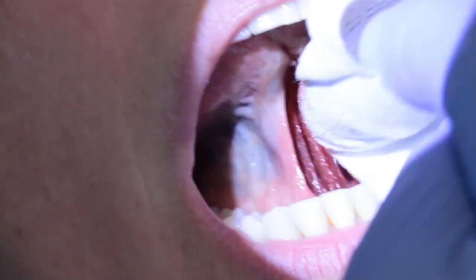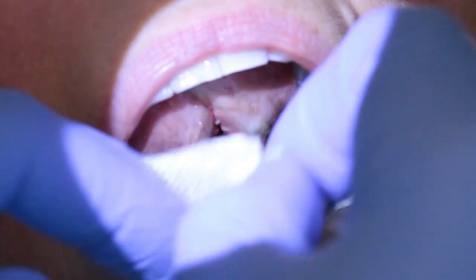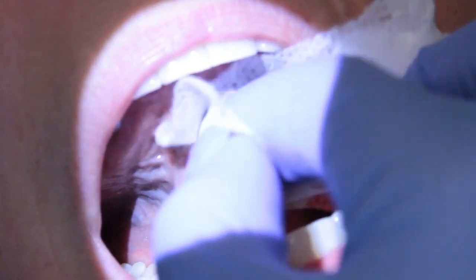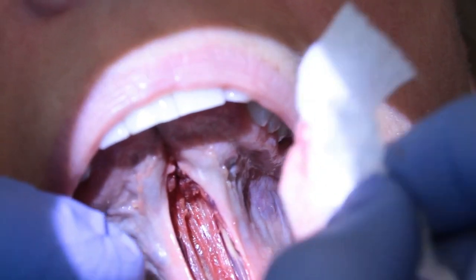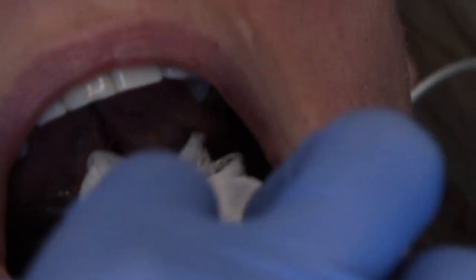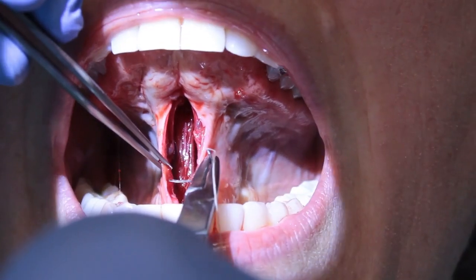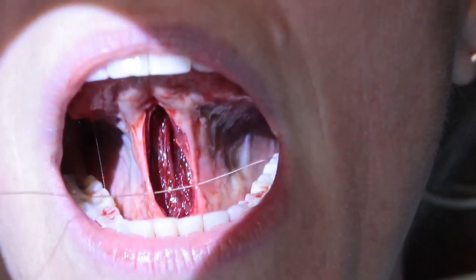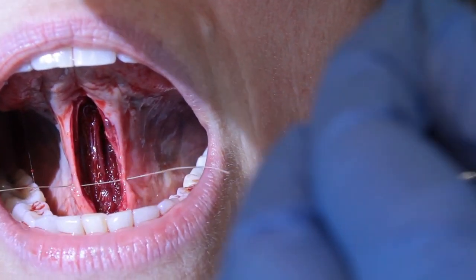So you guys can see that I'm just using my finger blunt dissection, and the tissues are actually spreading apart. There's one fiber there — it's just separating in. You can see it — it's that white one. This is a case where I'm going to do figure of eight, because you can see how much tension there is on the floor of the mouth. See how it just kind of gapes open? I want it to be a tight closure, this first one.